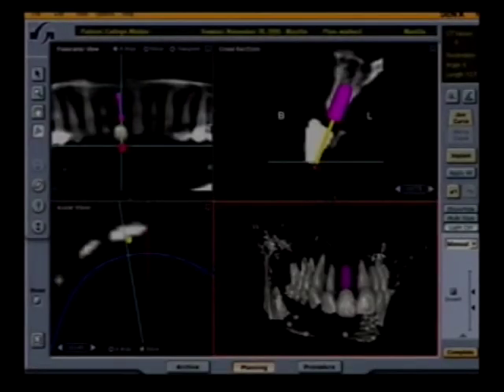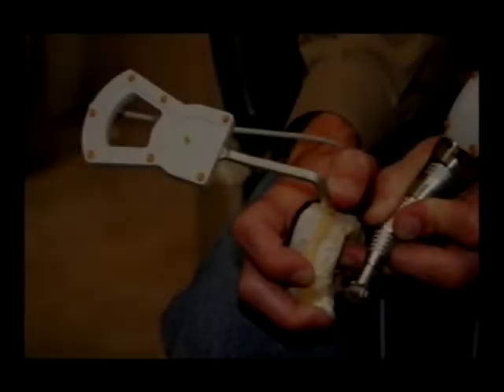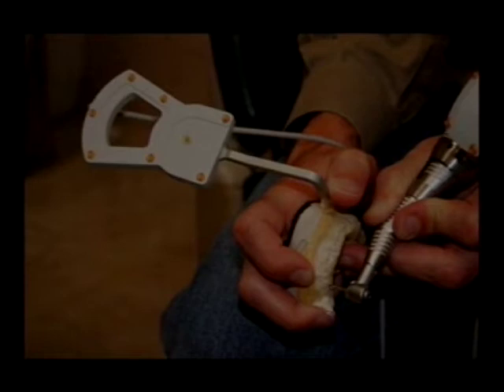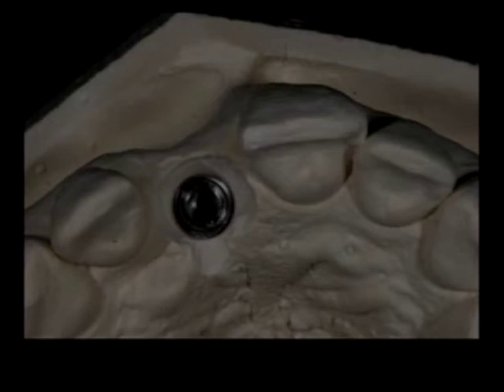Once we have that plan made, we then actually will perform the surgery on a cast of that patient's teeth. We also placed immediate provisional restorations that same day. So Mike did the same things he's doing here — doing that surgery on the cast of the teeth that he's actually going to be doing. Here is the case with the implant placed on the model.